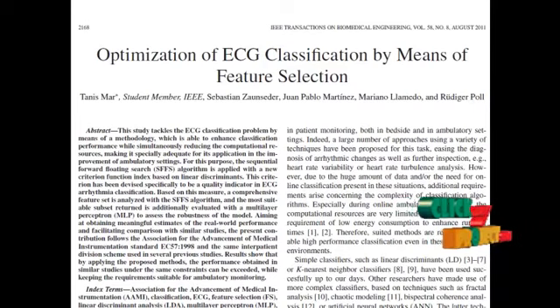With the help of this feature vector, we are able to classify it, but sometimes it will lead to some misclassification. To avoid this problem, we introduce a feature selection stage between the feature extraction and classification stage. By introducing so, we can improve the classifier performance and we can achieve high accuracy. Here we are going to introduce the sequential floating forward feature selection method.